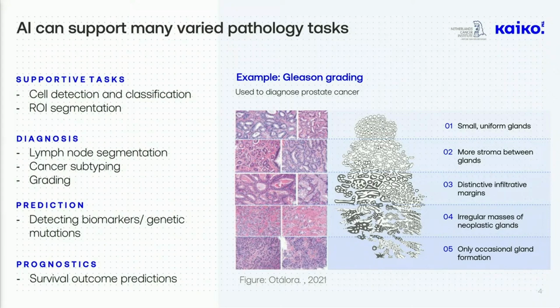However, a recurring challenge in medical AI is that we don't have a lot of task-specific labels to optimize these models. And this results in a challenge that it's very difficult to train these models in a very robust way and make them generalize well across different centers and on out-of-distribution data. On the flip side, we do have a lot of unlabeled data, especially for pathology, since H&E stained pathology slides are used in routine diagnostics of cancer patients. So, how can we utilize this unlabeled data?